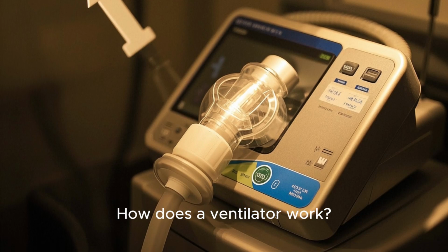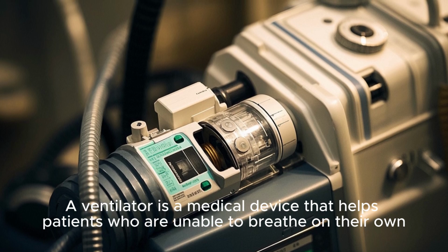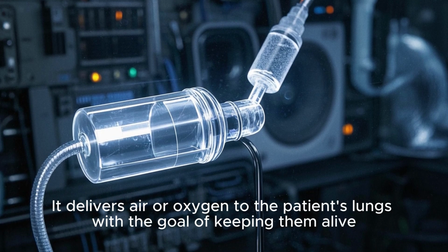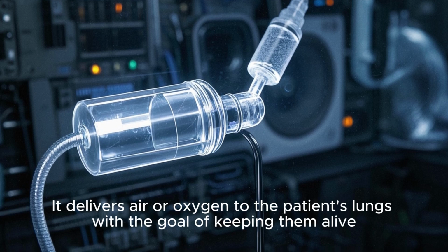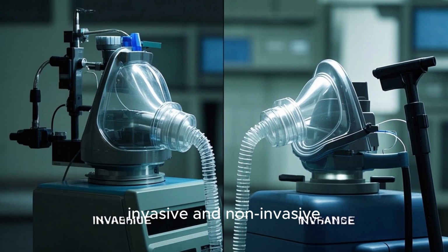How does a ventilator work? A ventilator is a medical device that helps patients who are unable to breathe on their own. It delivers air or oxygen to the patient's lungs with the goal of keeping them alive. There are two main types of ventilators, invasive and non-invasive.